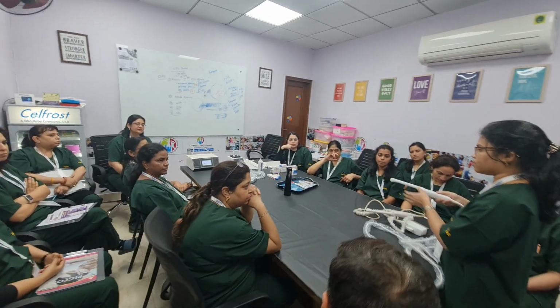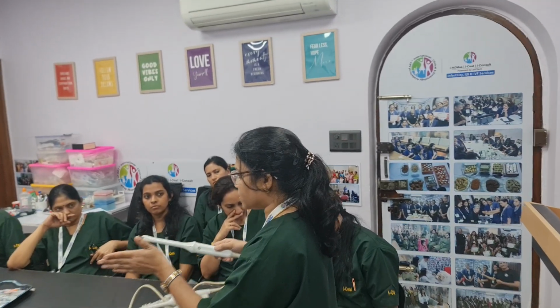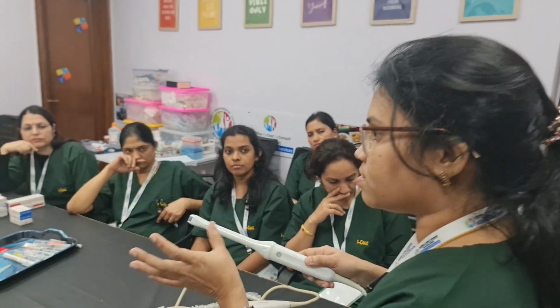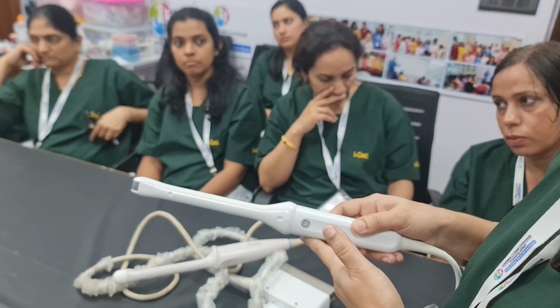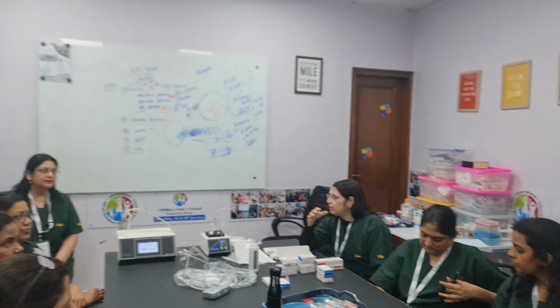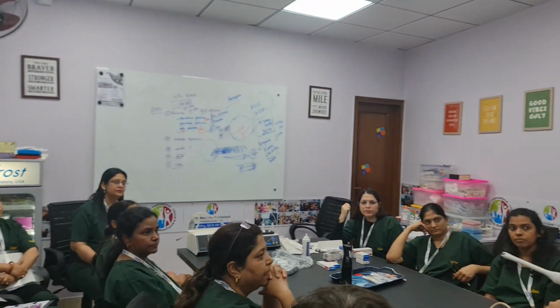I already told you that the marker has to be put up. When it is looking upwards, and we see the uterus in the sagittal section, just turn it 90 degrees, then we can visualize it in the axial section. When it is in the axial section, the one on the right of the uterus is the right ovary, and the one on the left is the left ovary, ma'am. In addition, whatever is towards the bladder is always anterior, and away from it is posterior.